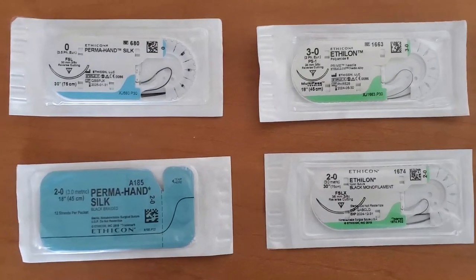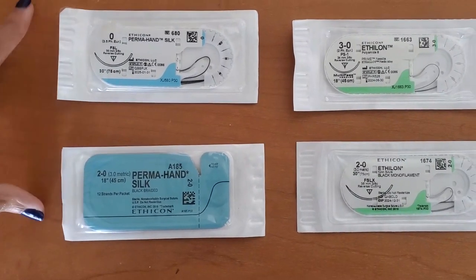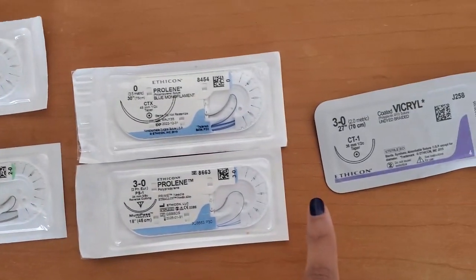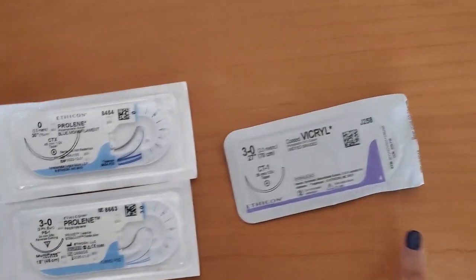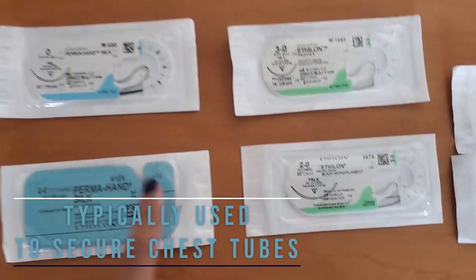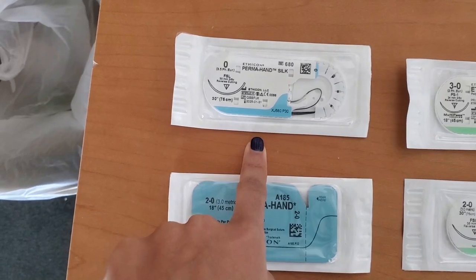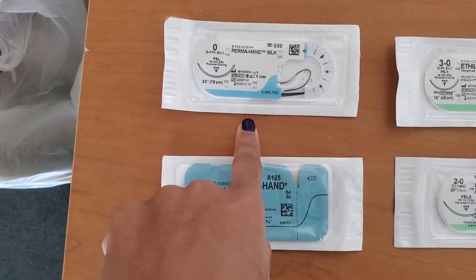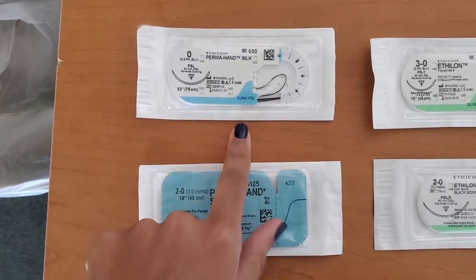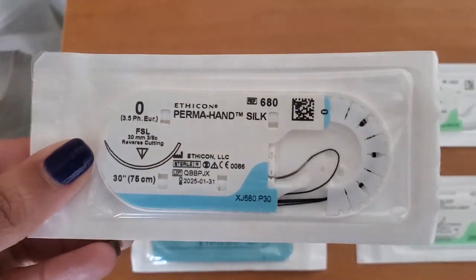So here I have for you guys some Permahand silk in different sizes, Ethilon again in a 3-0 and a 2-0, and then Prolene in an 0 and a 3-0, and Vicryl. And so we use these for various different things. We use the Permahand silk 0 whenever we're putting in a chest tube. Sorry, you guys, a little gown just fell, but this is used to secure the chest tube, and this is a non-absorbable silk suture.